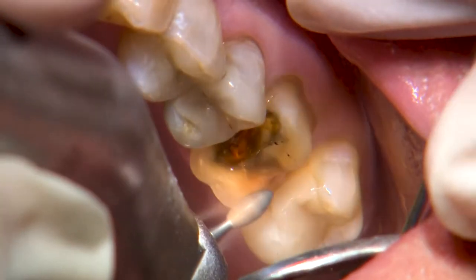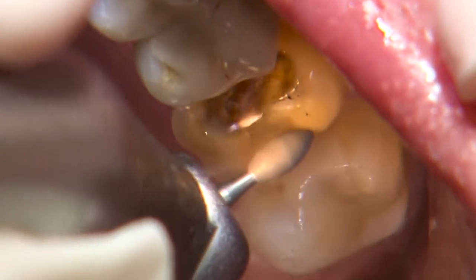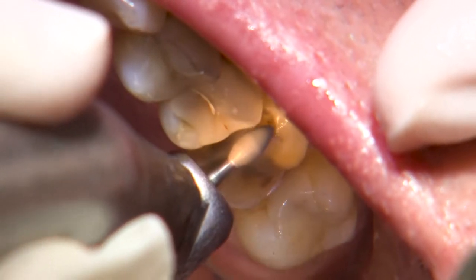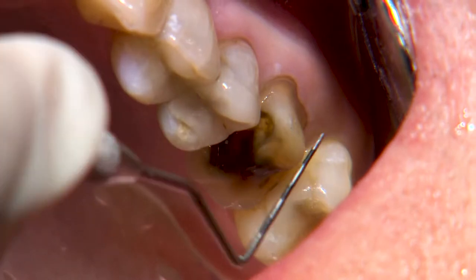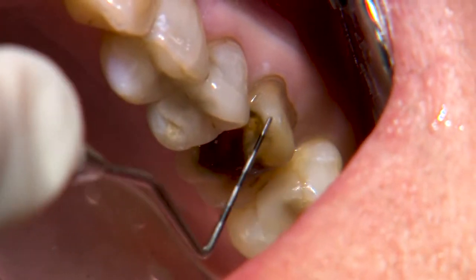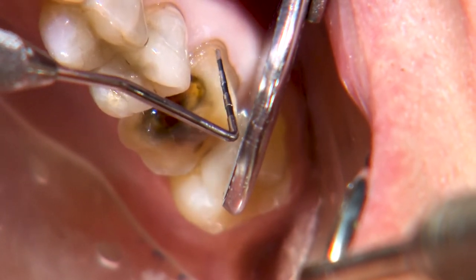When I'm finished making the bulk reduction on the axial and occlusal surfaces, I try to round over the internal line angles with a football or round bur to minimize any internal stress along our restoration. I also like to run a perio probe along the margins to evaluate the reduction and smoothness. The probe provides great tactile feedback of these two aspects along this critical area of our preparation.